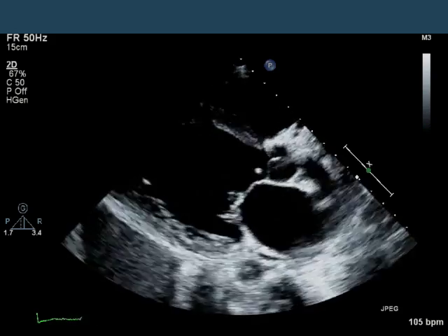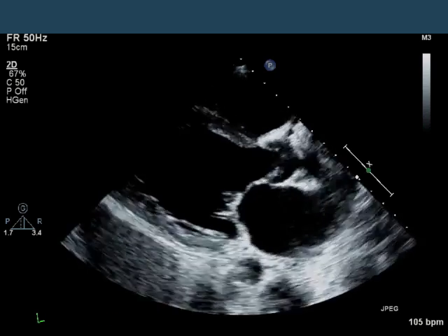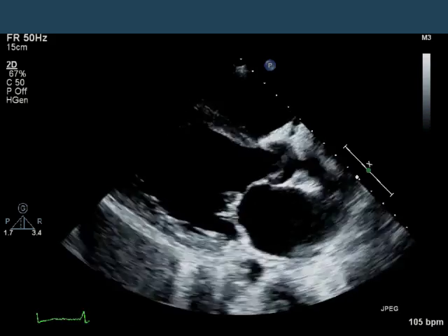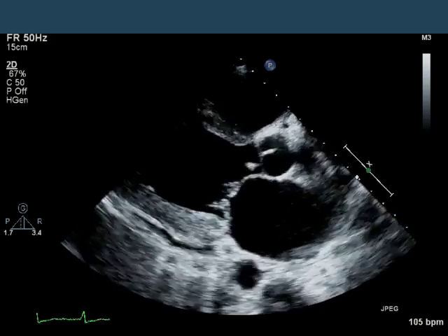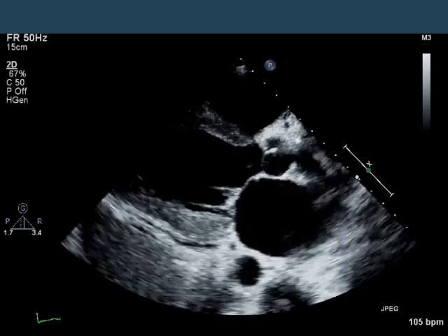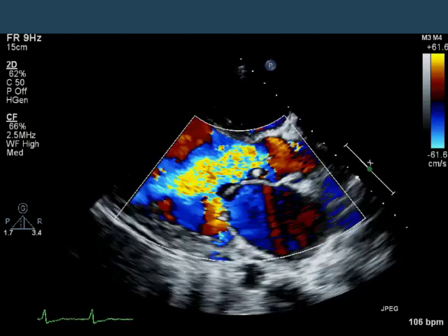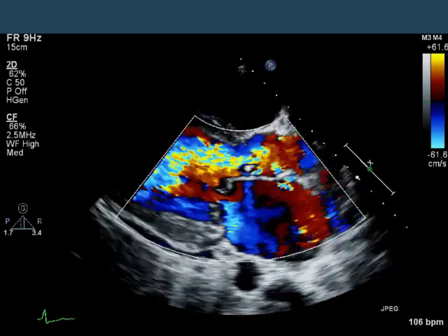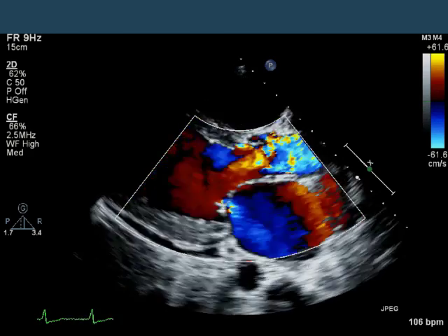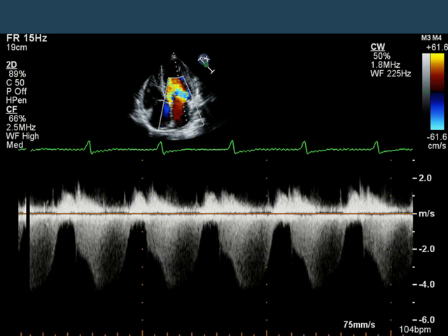Here's another parasternal long axis a week later. There's a small or trace pericardial effusion that wasn't there previously. The vegetation on the aortic valve is still present. The systolic function of the left ventricle looks about the same, and the left ventricular size doesn't look particularly different. When we put color on the valves, there's still no obvious change — we have severe mitral regurgitation and torrential aortic regurgitation. On the continuous wave Doppler of the mitral valve, the mitral regurgitation is again starting in diastole, reflecting the premature closure of the mitral valve from restricted filling, which is still present.